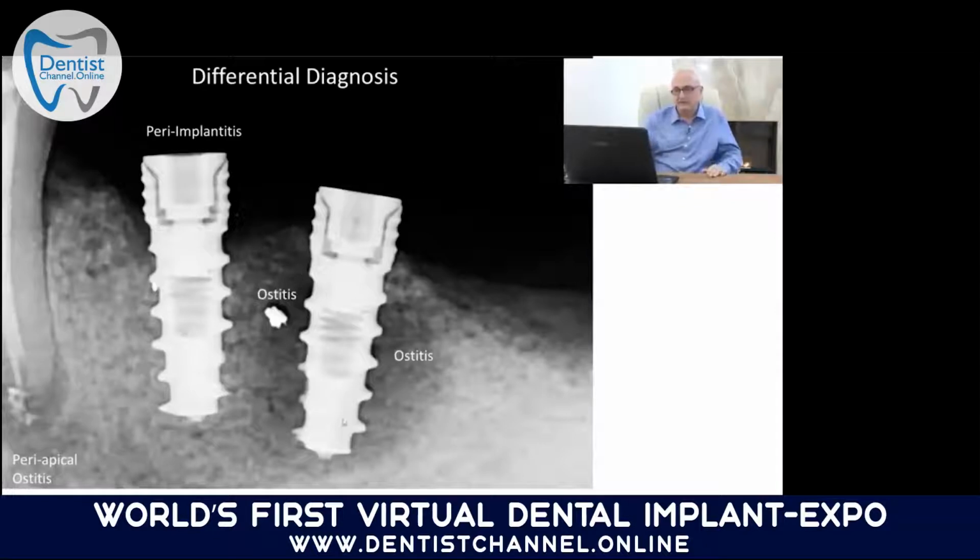And to understand the difference, this implant is in a little dark black ball, and this is what we call ostitis. It's an infection inside the bone. Here the bone is gone, periimplantitis, and here the bone is not yet gone. There's only a heavy infection. The mineralization goes down, and probably this is a piece of amalgam which was left inside the bone, or a piece of whatever. And this can, of course, maintain such an infection for many years. As soon as the implant is put in, this blows up and you get a real big infection, and quite true, this implant also gets lost after some time.